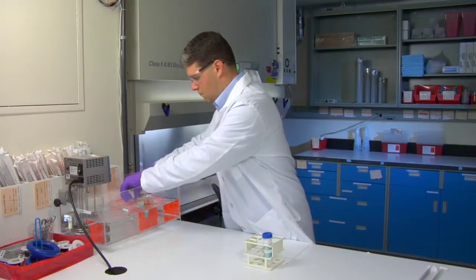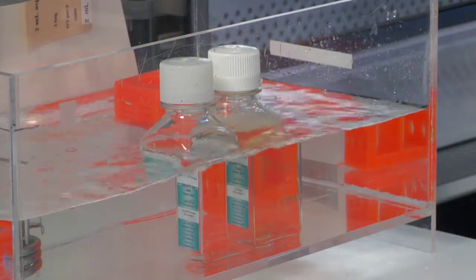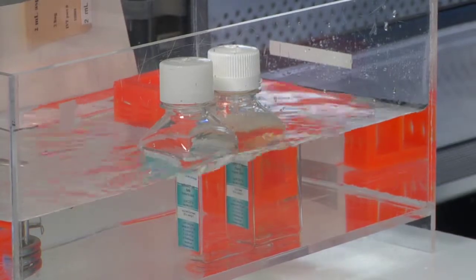Warm the 250 milliliter bottles of in vitro grow HT media and in vitro grow KHB in a 37 degrees Celsius water bath at least 30 minutes prior to use.